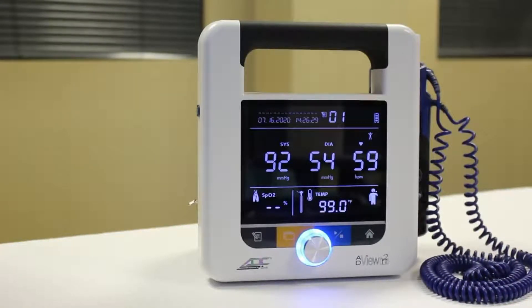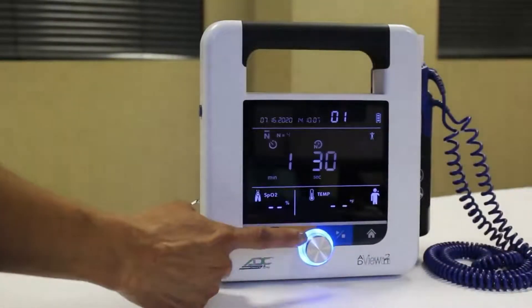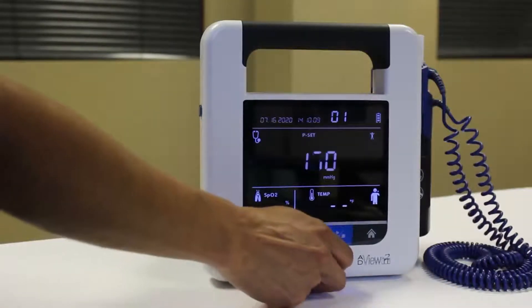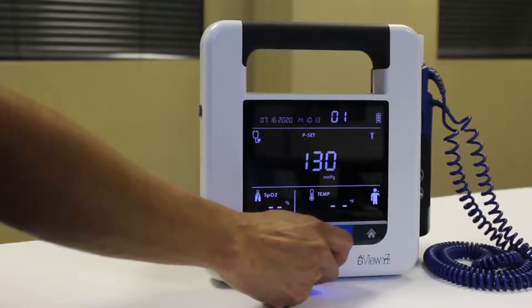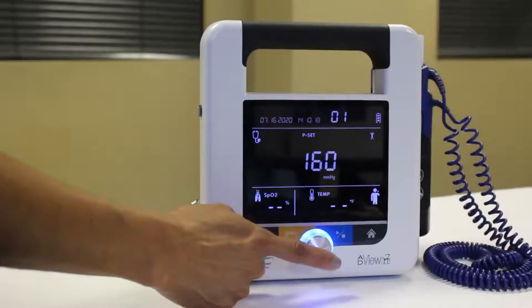A long beep will indicate measurement is complete. To take a manual blood pressure reading, press the Mode toggle button until you see the Manual Mode icon. The Pressure Setting icon and Selection knob will flash. To keep the default maximum cuff inflation setting of 160 mmHg, press the knob. Or choose another pressure level between 100 to 280 mmHg and press the knob to select. The device will remember that pressure setting the next time Manual Mode is used.